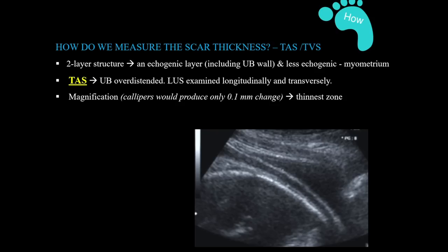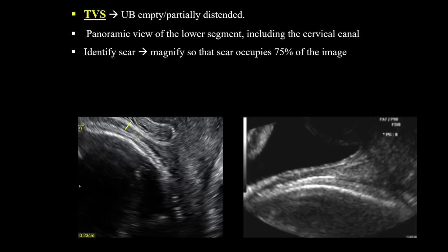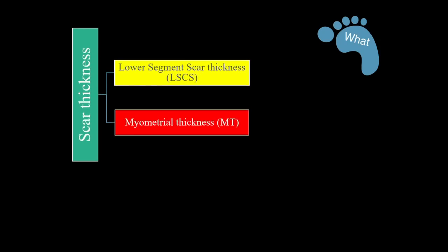When magnified, caliper placement should not cause a change of more than 0.1 millimeters, ensuring accuracy in calculating the thinnest zone and reducing error rate. For transvaginal scan, the bladder should be empty or partially distended. A large view with a midsagittal image including the cervix is taken. Once the lower segment is identified, it is magnified such that 75 percent of the image includes only the scar, again to reduce error when placing calipers.